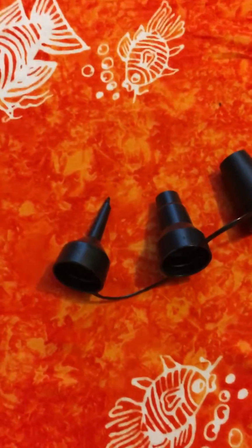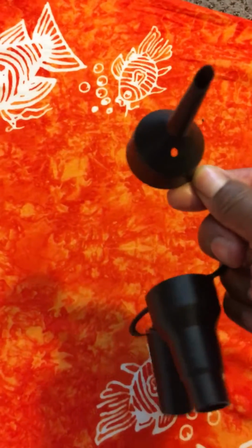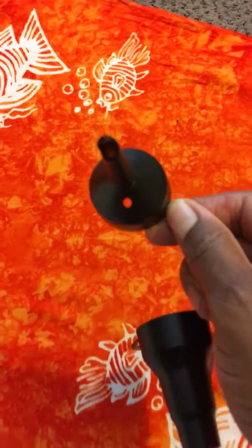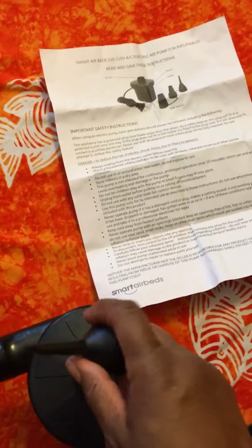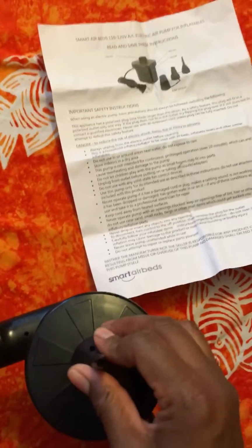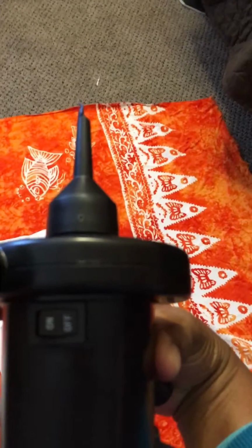Now, in the case of the shampoo bed, I ended up using the nozzle with the small size. What I do is I take this nozzle and I put it on top of the air pump itself. There we go. And that's how we're able to use it. There's the on and off button.